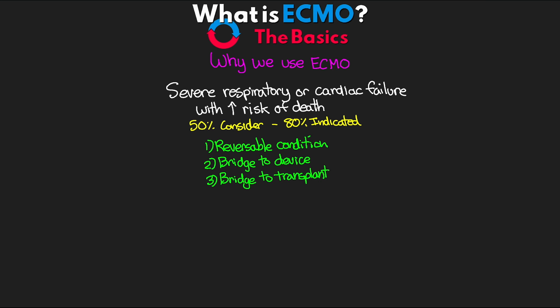And the reason to understand this and to really kind of think about why this is because ECMO is not any sort of treatment. ECMO is not going to fix the underlying problem of whatever's going wrong with our patient. It's merely a form of life support that's going to allow us time either for our patient to heal naturally so that we can come off, or in the cases of a device or some sort of transplant, to buy us time in order to be able to either implant a device or to be able to get an organ transplant. So again, really key takeaway here, ECMO is not a treatment. It's not going to fix your patient.